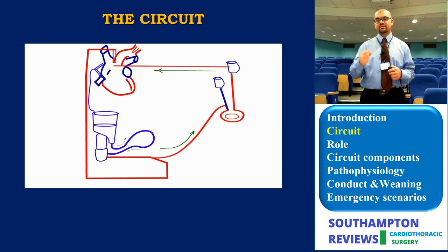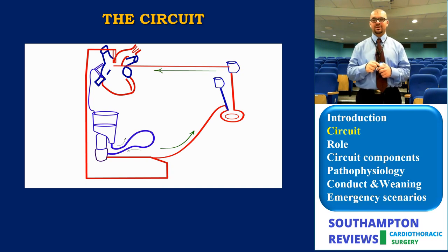This is achieved by the fact that the tube size difference between the blood and cardioplegia is 4-to-1. So the tube leading blood into the pump is 4 times bigger than the tube leading cardioplegic solution.